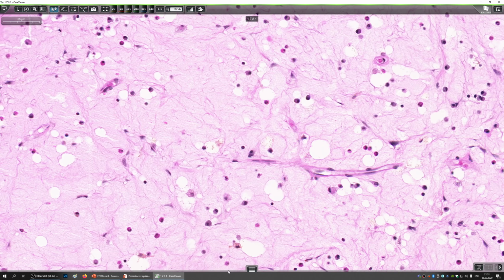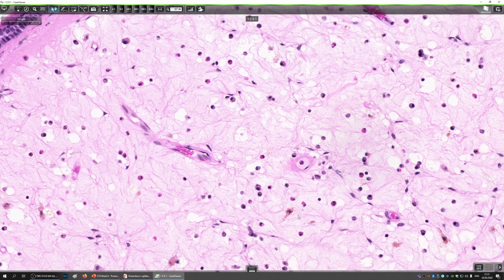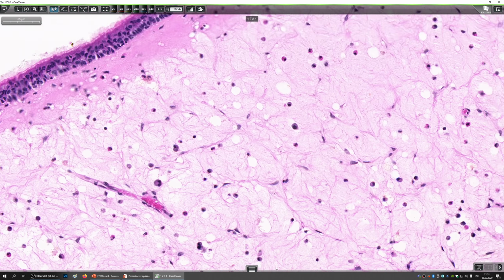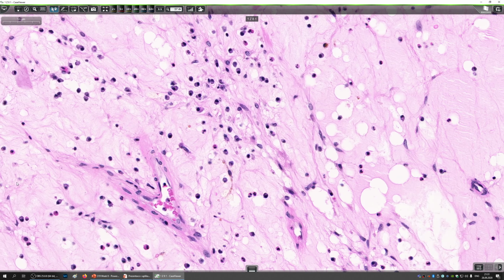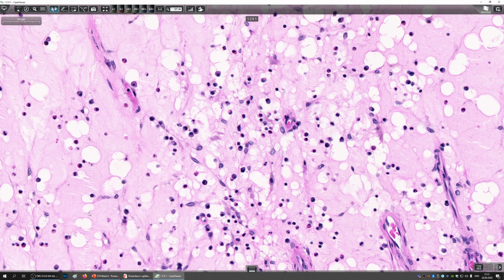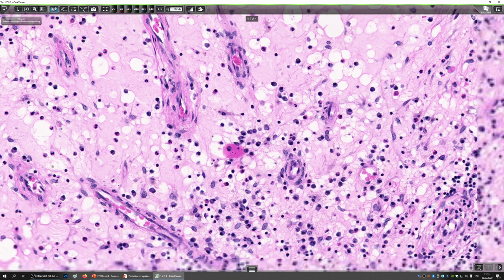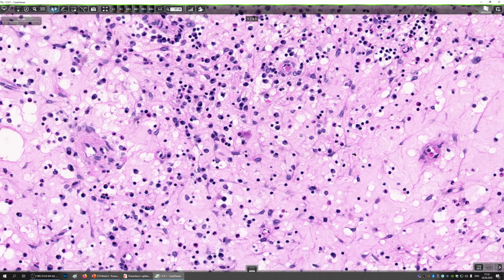I will just check if we see any Russell bodies. Who knows, maybe there are some. Let me just breeze through it. But you can see Russell bodies in the other slide from the previous lecture. So I hope your Russell body needs will be satisfied with that slide.